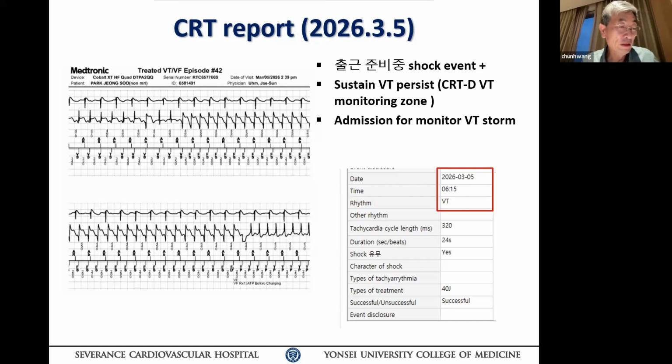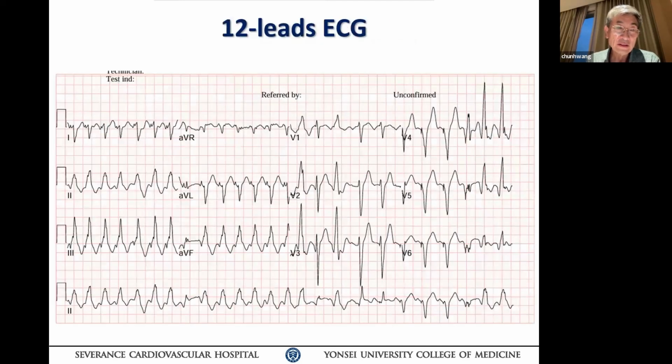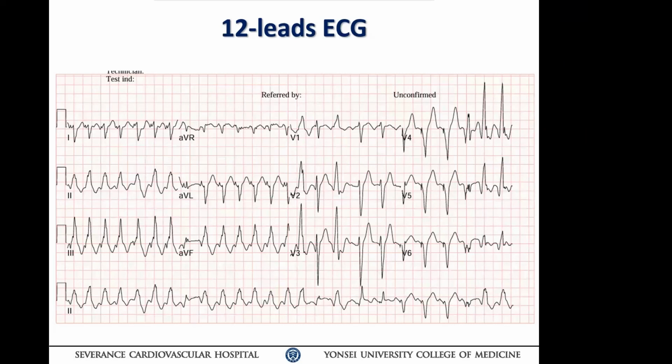If that sharp spike on the ECG is indeed a potential, go back to the first ECG. Yeah, right there. This P wave looks like a sinus P wave, assuming that lead 2 is upright. You can see the P wave in and out of a QRS complex. Yeah, that sharp front, positive. Lead 3 may be biphasic. Lead 1 is also notched. AVL is also biphasic. What do you think? Is this a normal sinus rhythm or not? Maybe not. Yes, it's probably ectopic atrial tachycardia.